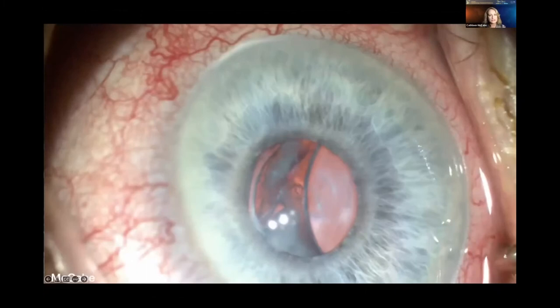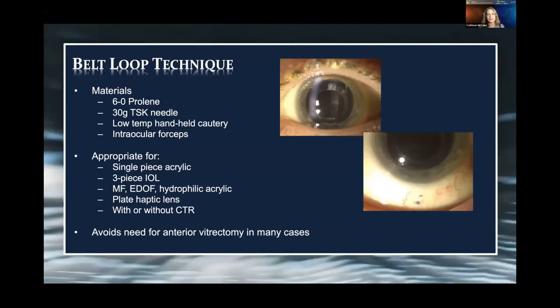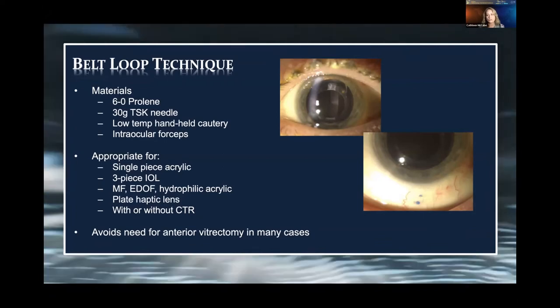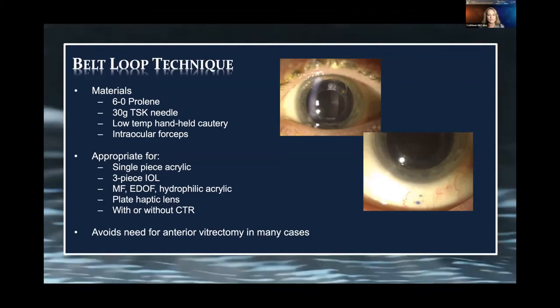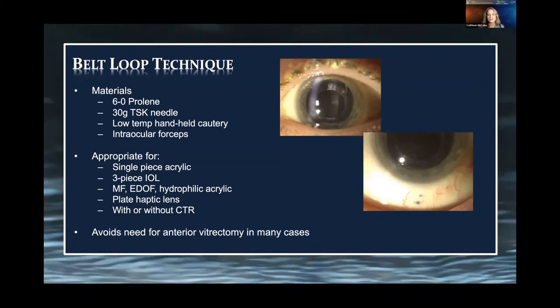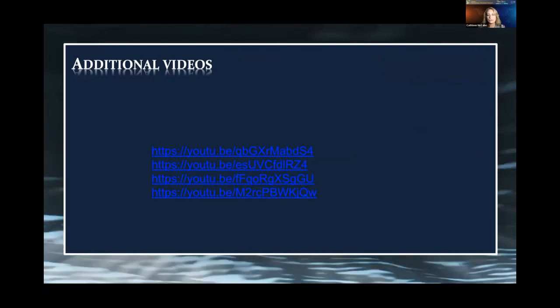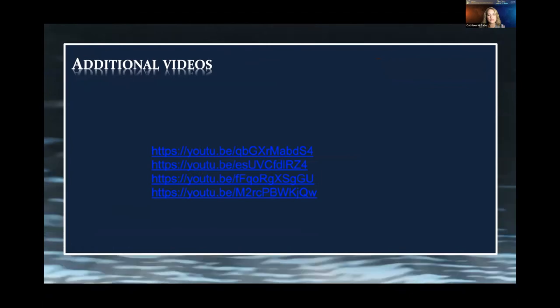This technique uses 6-0 proline — the needle doesn't matter, I'm not using the needles on it. 30-gauge TSK thin-wall needle. Low-temperature handheld cautery. Intraocular forceps are very helpful. It's appropriate for just about any lens design — I've done it with multiple lens designs with or without a CTR. A CTR is helpful as it gives you something else to belt loop. It avoids an anterior vitrectomy in many cases. There are a lot of YouTube videos if you need to look at other lens types.